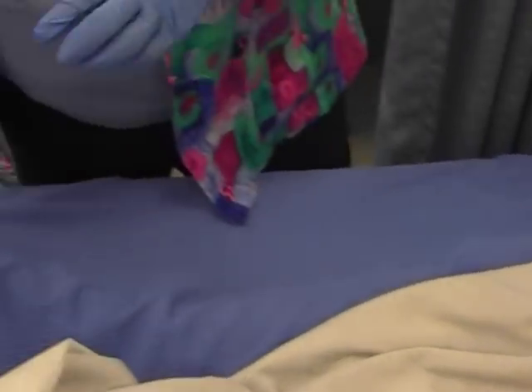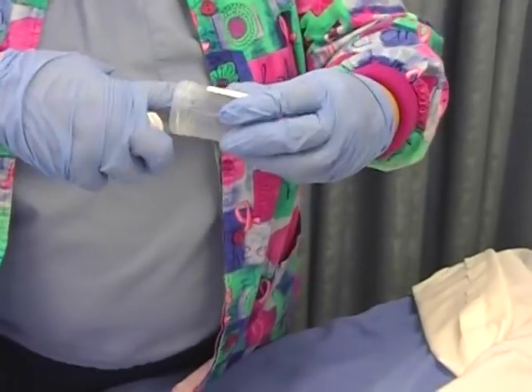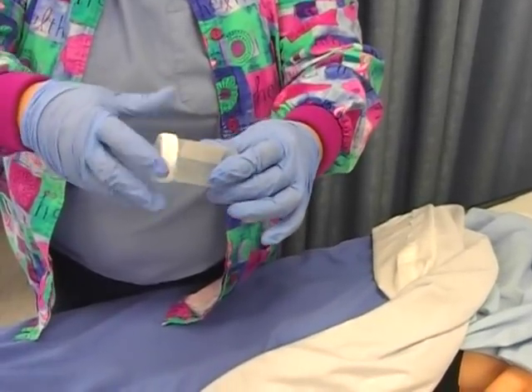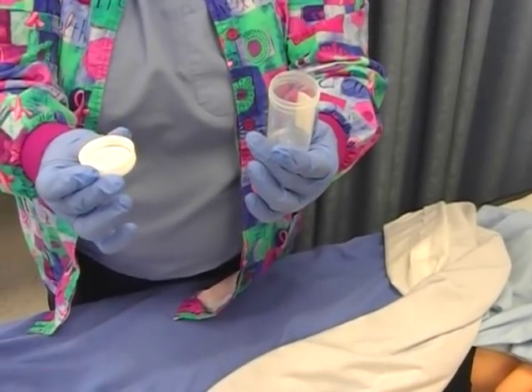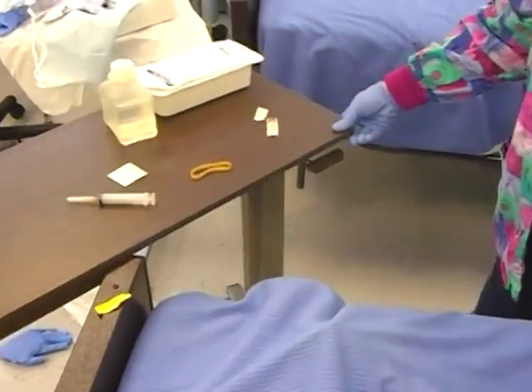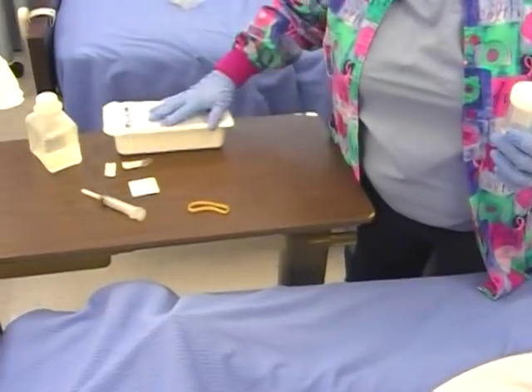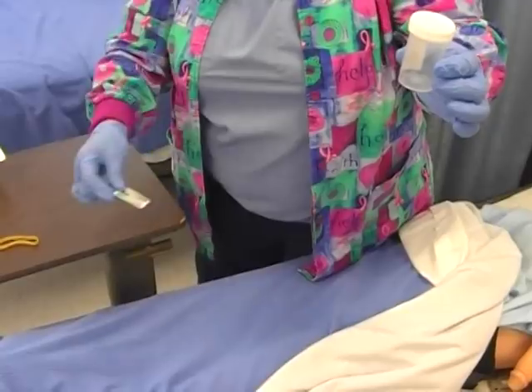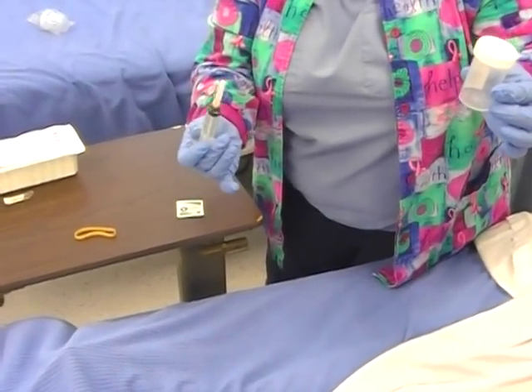You need a specimen cup in order to put the urine in. You don't want to be touching inside the lid — keep this as clean as possible. It's not a sterile procedure; it's just clean. Make sure you have an overbed table to work with and put your supplies on it. You need a specimen cup, an alcohol pad, and either your needle with a syringe or just your syringe if it's a needless system.